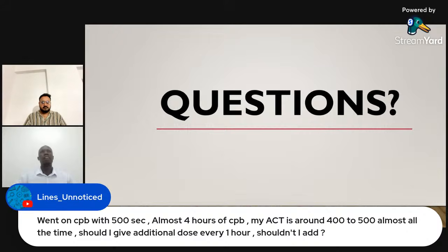One thing we do at the center is we really maintain our ACT above 480, and at some point, as you have said, your ACT has gone down to around 400. Remember, your target is 480. So you need to add, to maintain your ACT above 480.